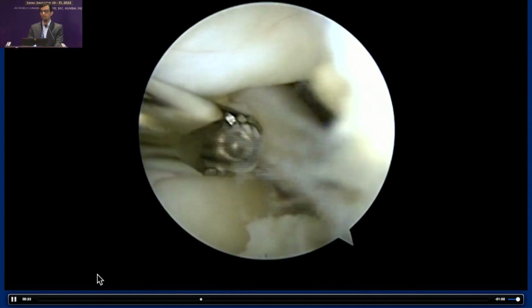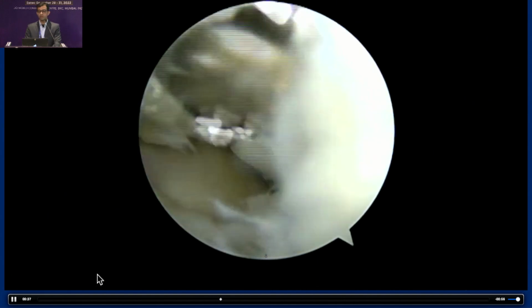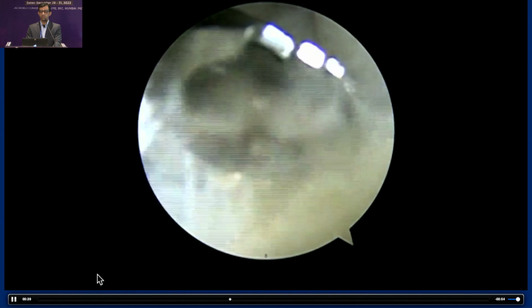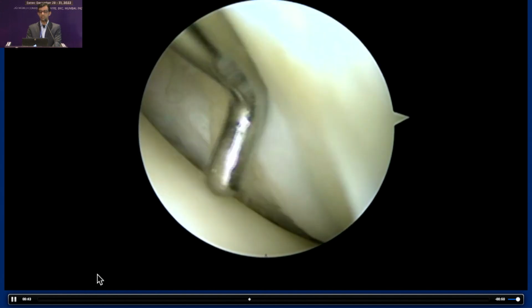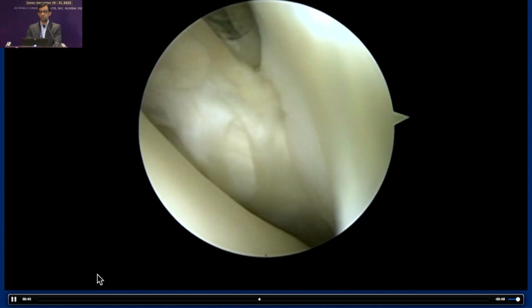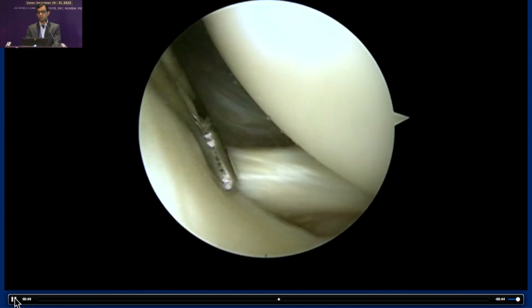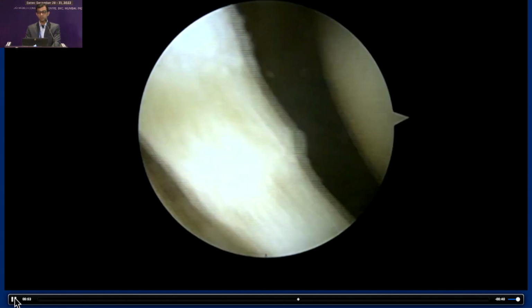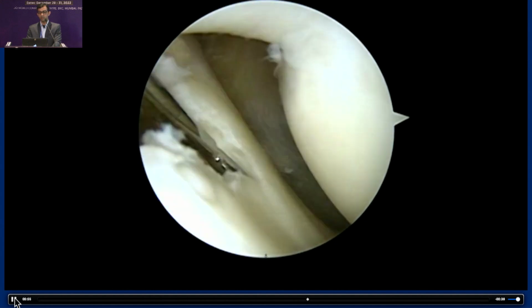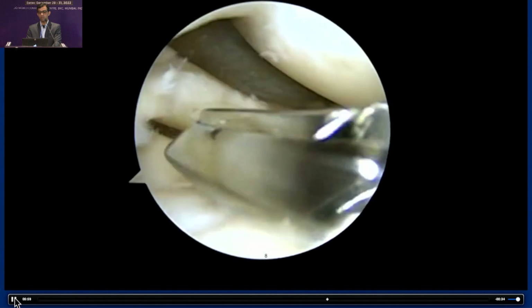You should be having right and left arthroscopy punches as well. It will save time. Routinely debride the infrapatellar fat pad to get the vision properly. See the attachment peripherally onto the under surface of the meniscus as well as to the over surface of the meniscus. This is the popliteal tendon. This is quite a stable meniscus, so go ahead with further debridement to make it a saucer-shaped meniscus looking as normal as possible.